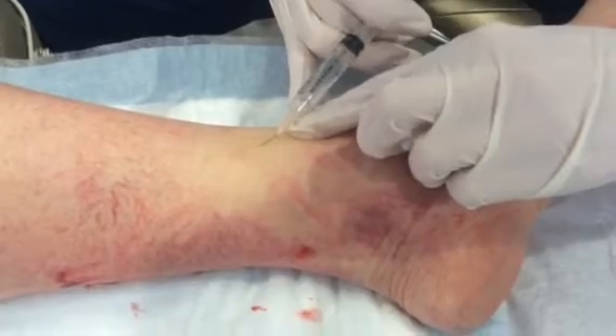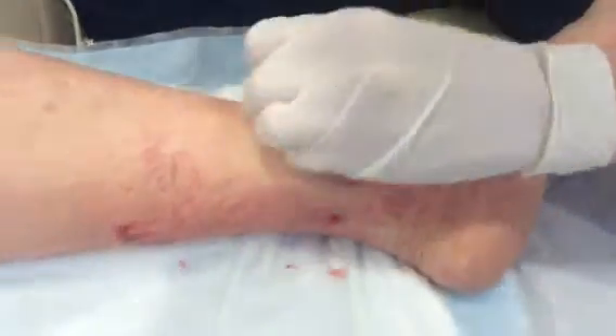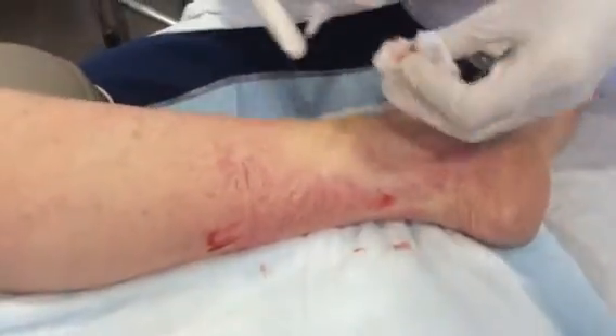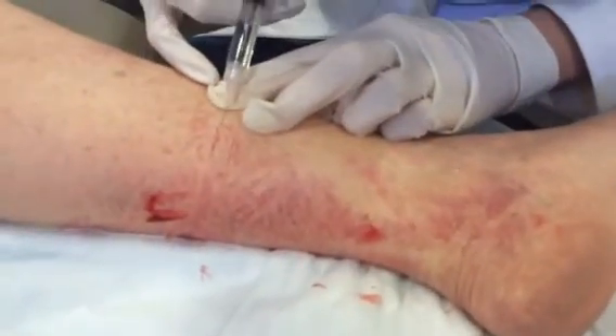Some of the discomfort you can see with older solutions like hypertonic saline. We got about two thirds of that little ankle area with that, so we'll try one of these over here.